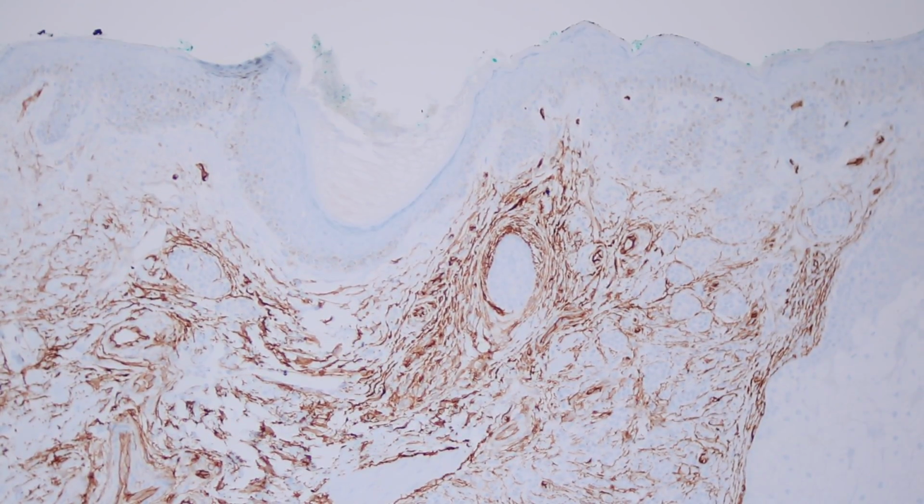CD34 is a useful stain in certain contexts, but you've got to be really careful with it because it stains a lot of different things, particularly fibroblastic proliferations of all different sorts can be CD34 positive. So dermatofibrosarcoma protuberans is CD34 positive, and people often use CD34 as a marker to look for DFSP, but you have to remember that a lot of other spindle cell tumors express CD34, vascular tumors usually express CD34, and most importantly, the normal dermis has strong CD34 expression.